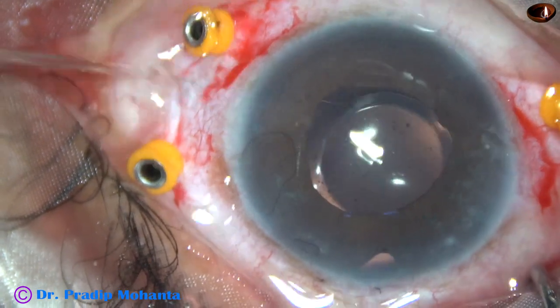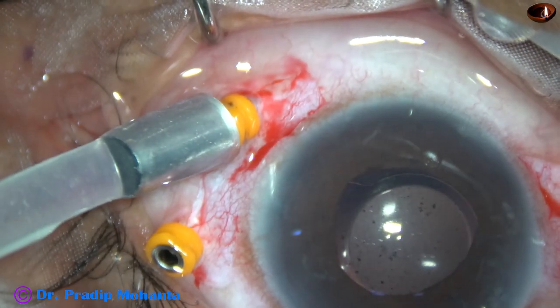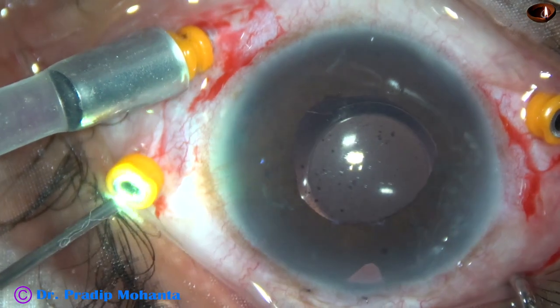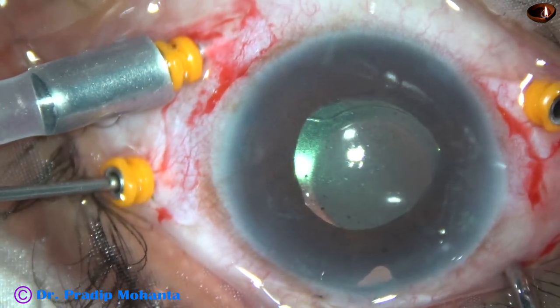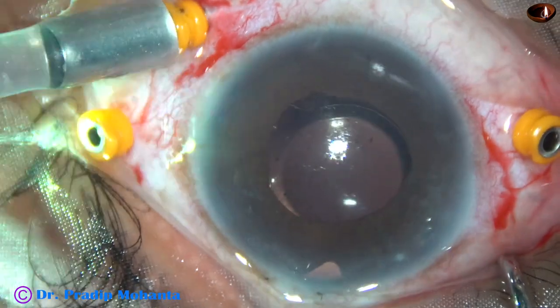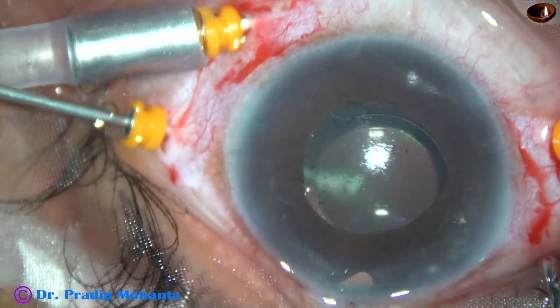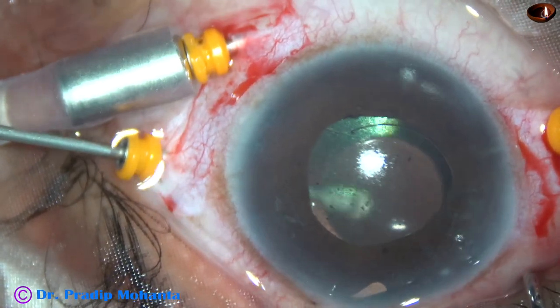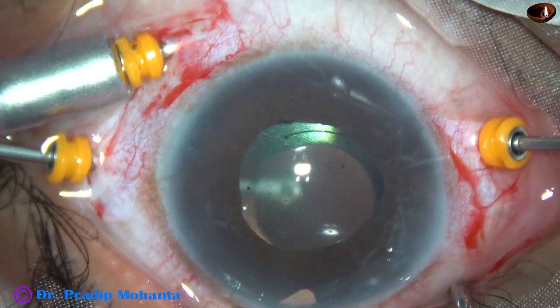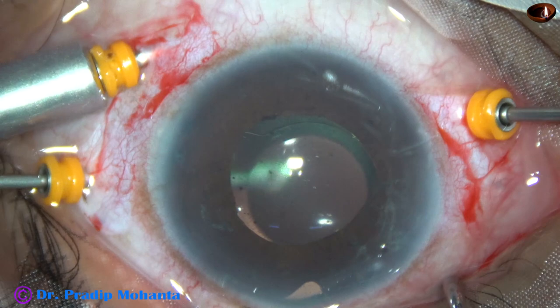The infero-temporal trocar is being used for irrigation. The other two trocars will be used for the endo-illumination and cutter. I tried doing it the standard way but it was cumbersome because the nose was obstructing the cutter, so I took the light pipe in my right hand and the cutter in my left hand. The machine settings are 3,000 cuts per minute, vacuum 300, and flow rate 30.